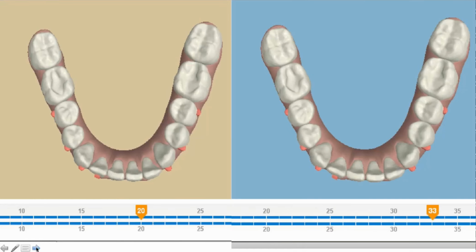If you look on the left side, you'll see that that's where they look at aligner 20. And then that's exactly the same position they look like at aligner 33. That means the aligner took from 20 to 33, 13 extra aligners of insurance. If the position was correct at 25, you can jump to 33. If the position was correct at aligner 30, then you can jump to 33. It's just insurance that's built in so that you have greater force. I already had learned my lesson from the first set of aligners.